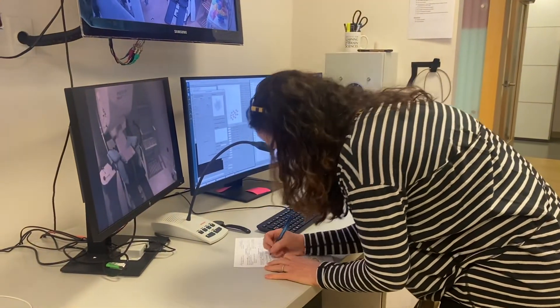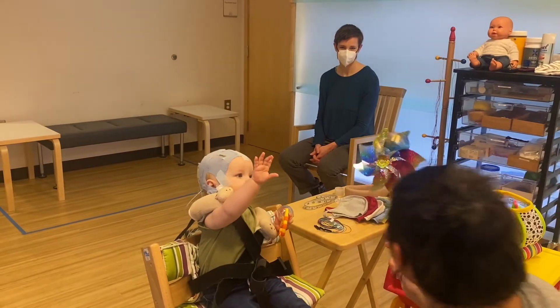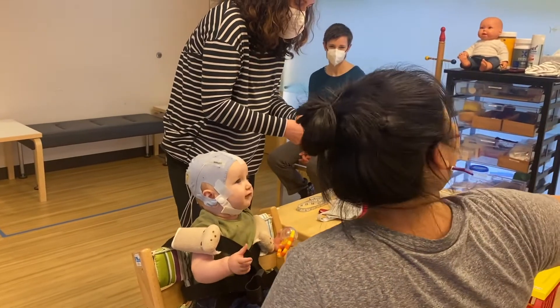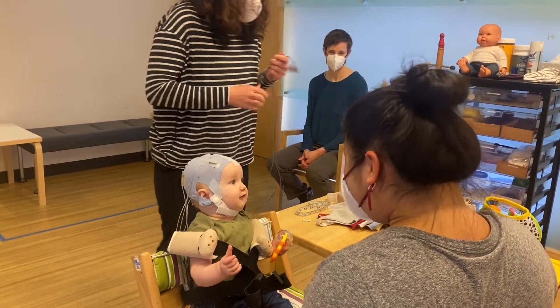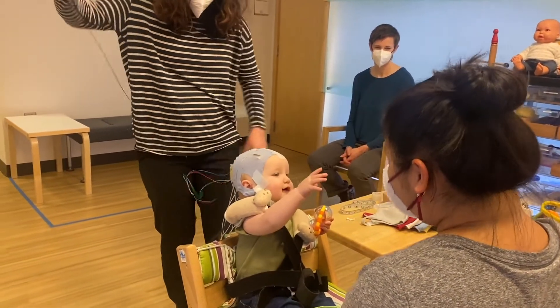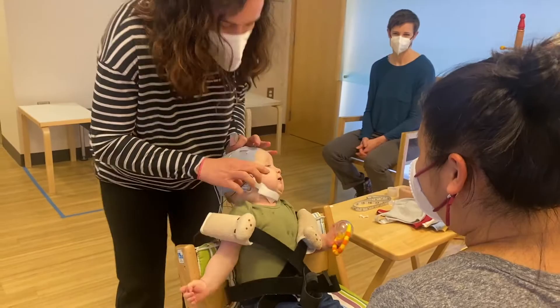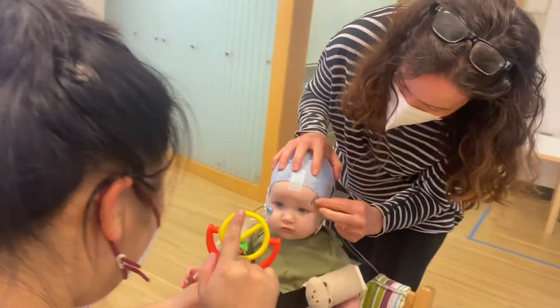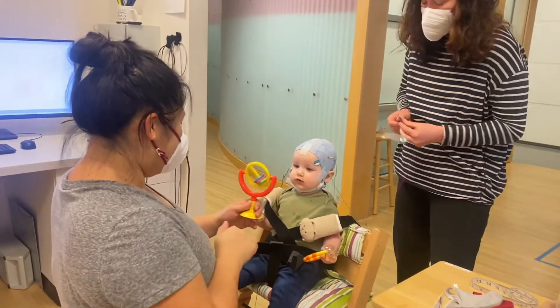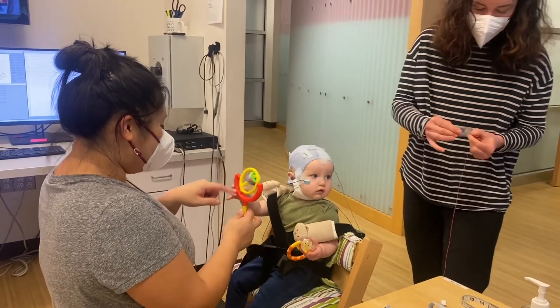Once finished, the technician writes detailed notes about the digitization process. Now the technician places the EOG and ECG electrodes on the infant. Electrode placement is important for good signal quality. We also want to make sure the infant can't tear off the electrodes during the measurement. We place two EOG electrodes on the infant — one slightly below the eye and the other near the orbital rim above the opposite eye. This allows us to capture both blinks and saccades while minimizing the number of electrodes. We place ECG electrodes on the chest and on the back of the infant to measure the electrical signals emanating from the heart.